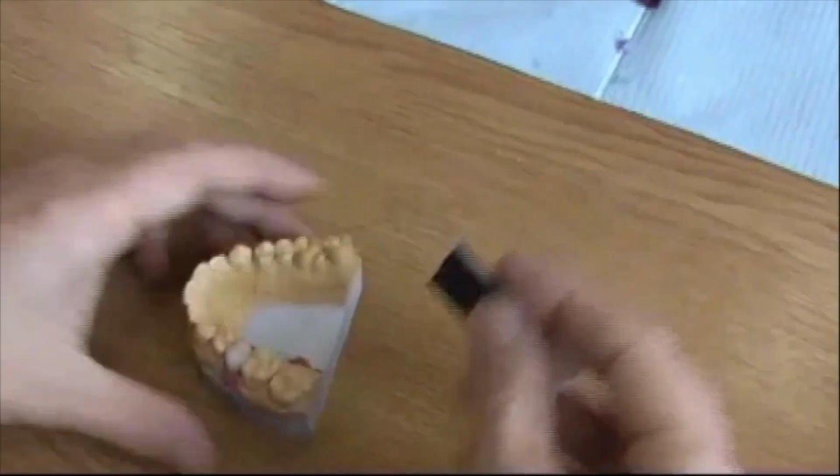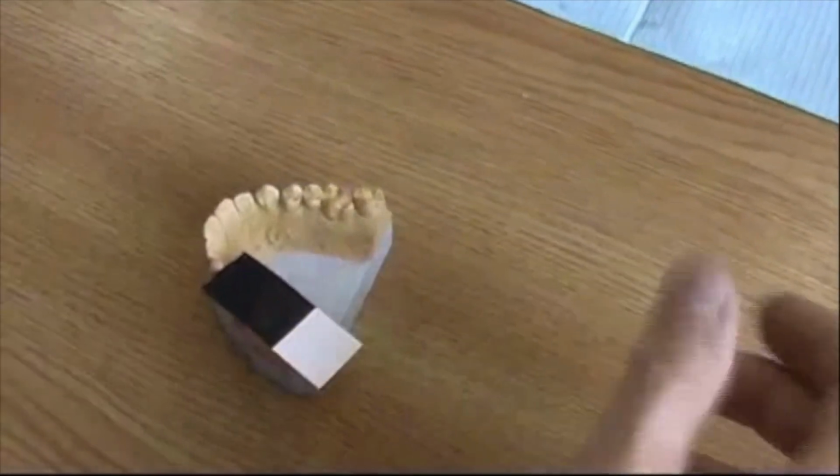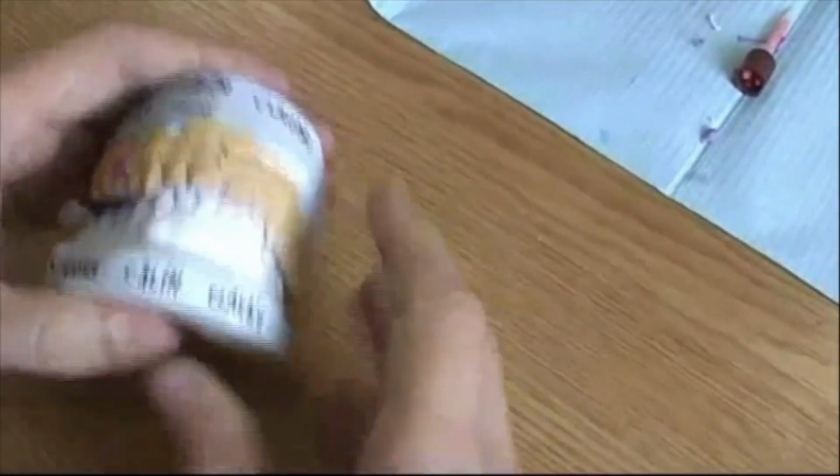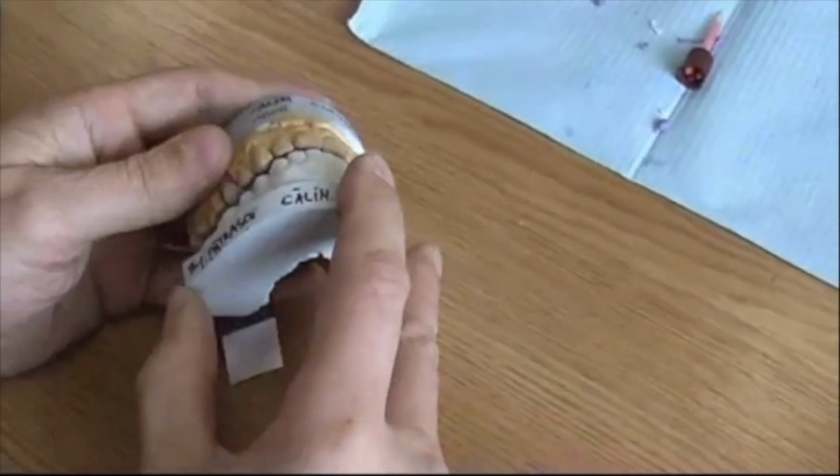See, now we want to check the articulation. You say, okay, but this is the temporary. Yeah, it is a temporary, but we don't want to have the jaw of the patient deflect from the condyles in order to avoid high spots. We don't want this to happen. So the temporary crown has to be as perfect as a final one.